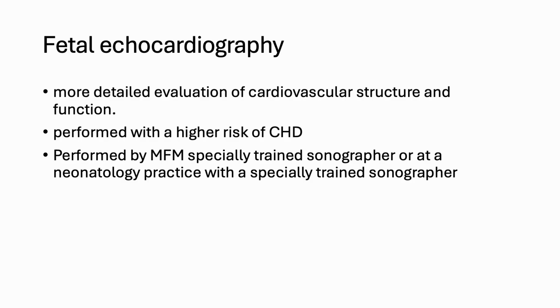So we would send our patients that needed this test to the children's hospital in our area, where they would have a visit with the neonatologist and have a sonographer do their sono there, and then the neonatologist would do another look at the ultrasound.